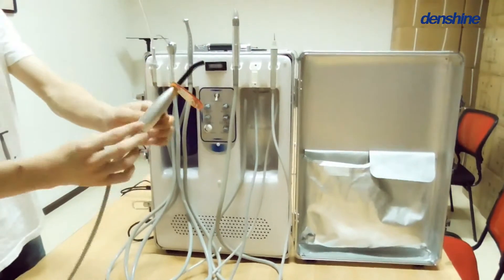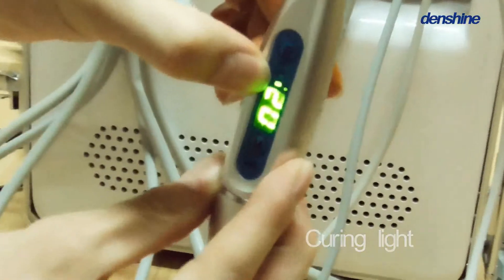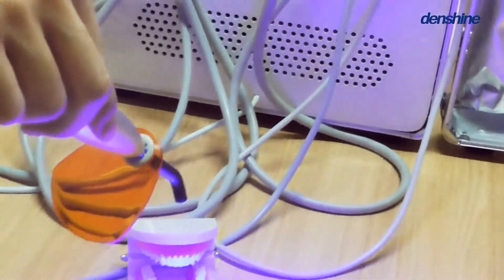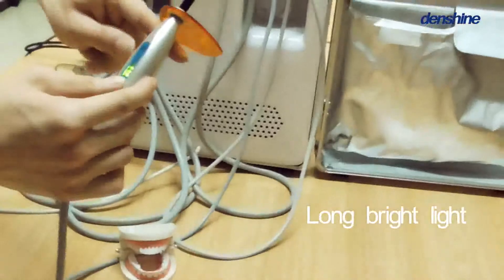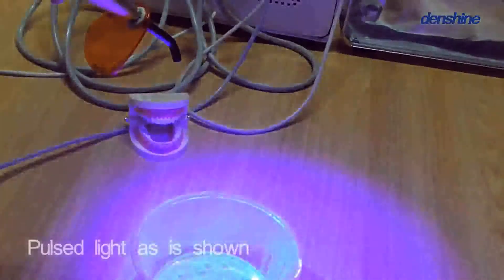And this is the curing light. There are three modes on it. Mode 1: long bright light. Mode 2: pulse light, as is shown.